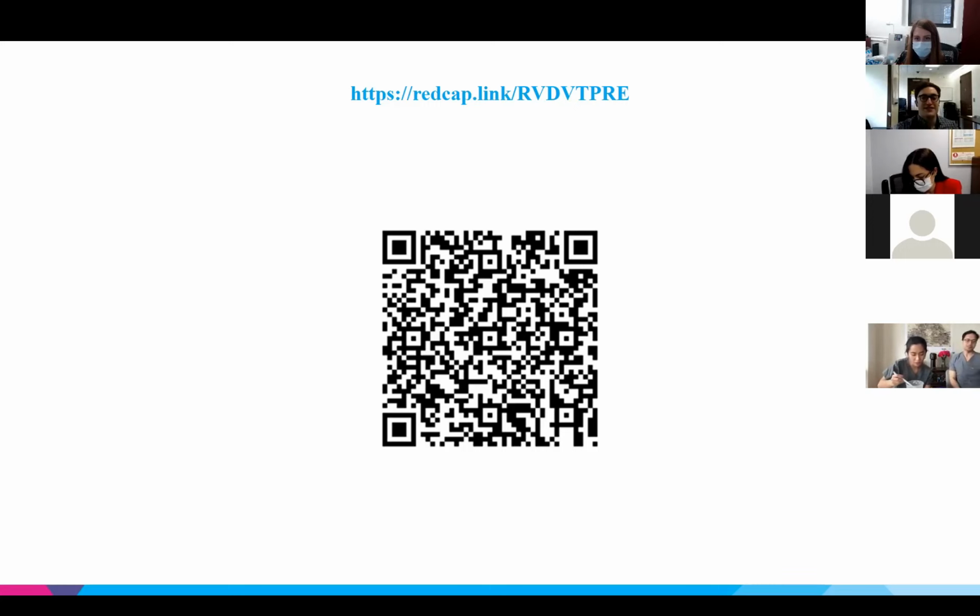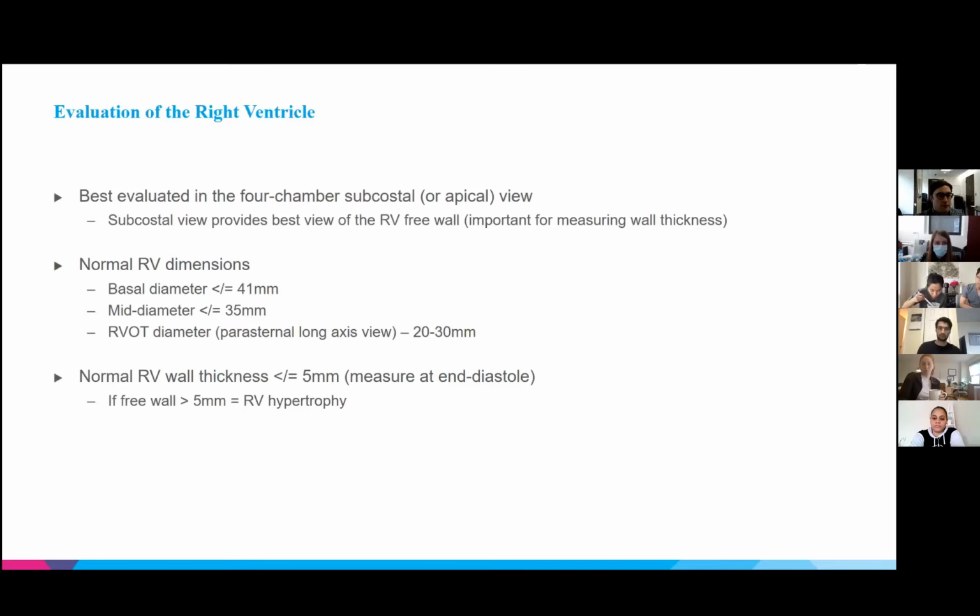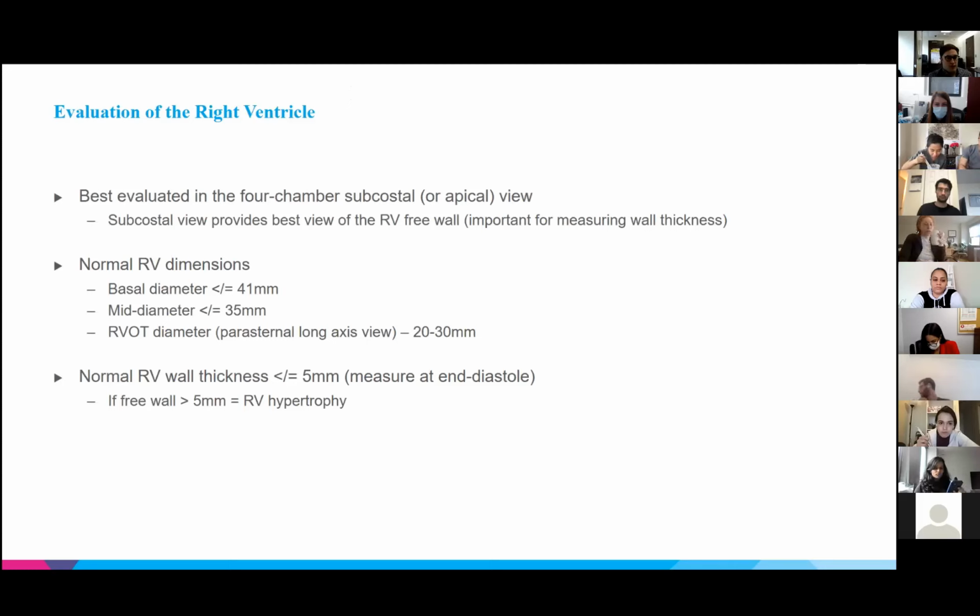I don't know what your thoughts on the test were, if you felt good about it, if you weren't sure what the answers were for some of the questions, but hopefully by the end of the talk, you will feel much more confident. So basically what we're going to do is start by first evaluating the right ventricle. So how best do we evaluate this?